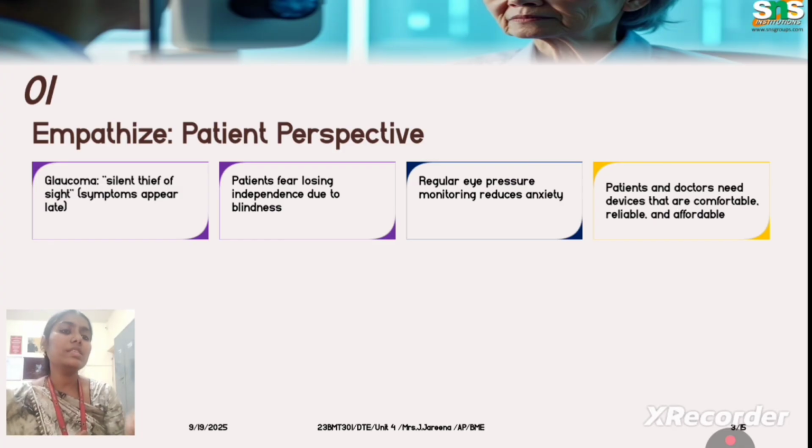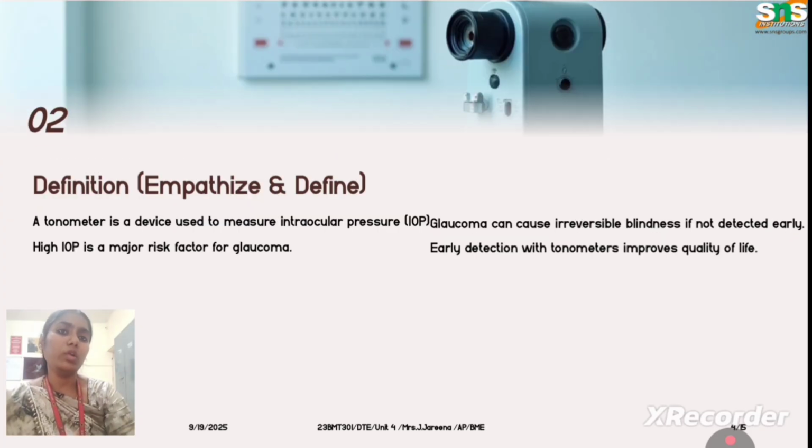So that is the reason, if we have an affordable device, then it will be easy for the doctors and the patients to detect this condition, to avoid blindness, and also to boost their confidence level. So this is the empathy for having this particular tonometer.